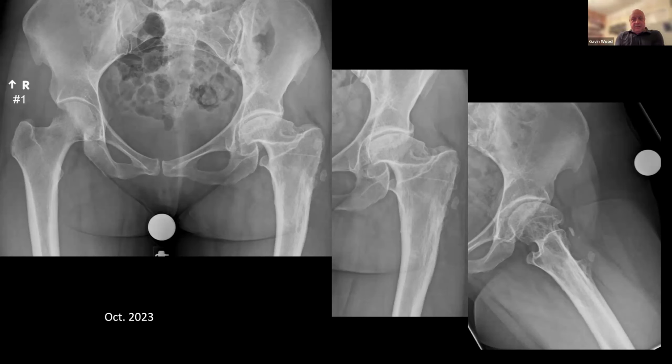First of all, I'd say that the acetabular side is probably going to be the easiest part of this case. There doesn't seem to be really much in the way of acetabular deformity. Even looking at the lateral on the other side, columns all look reasonable, bone stock looks reasonable. So I think a cementless cup there isn't going to pose too much in the way of issues. I would like to try and get down to that medial floor.